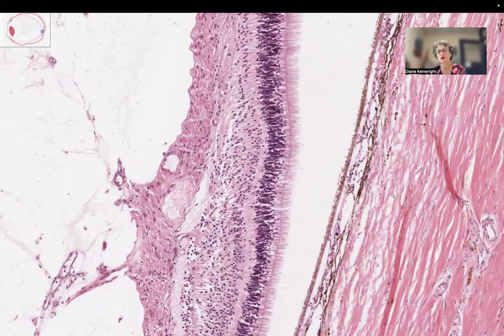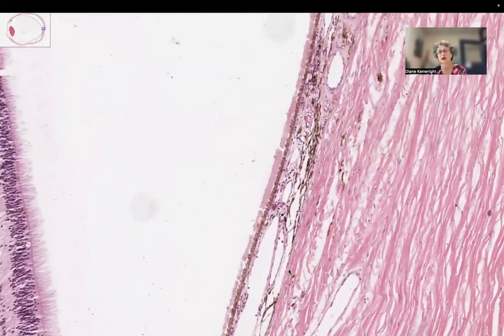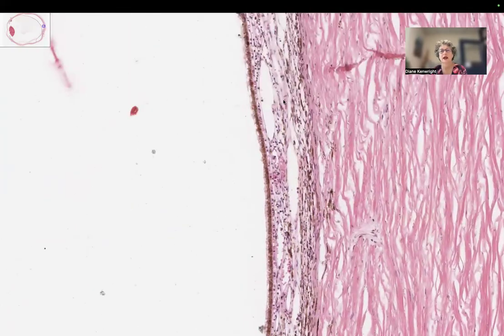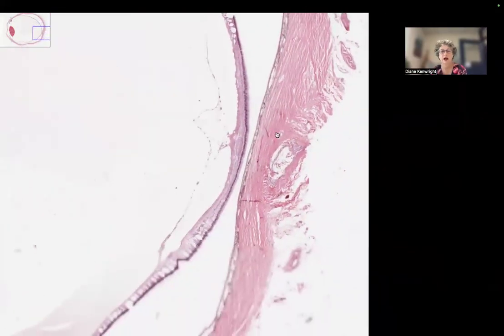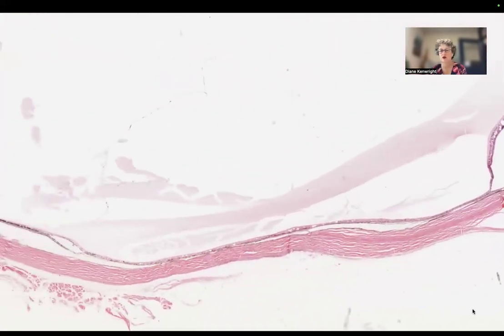I'm just going to scoot through the choroid here to see if I can find any diabetic vascular changes like wall thickening. And it is really not leaping out at me. You might argue those are slightly thick, but it's not showing that nice hyalination that we get with diabetes. Ah, well. Okay, and if we come around here, we notice similar changes, and then we're back at the front of the eye. So I think that's all the features of this eye, and I will stop recording.